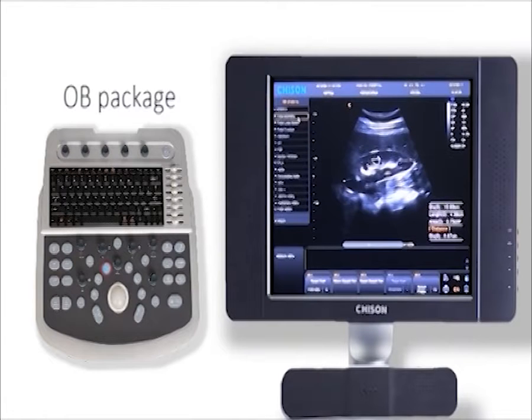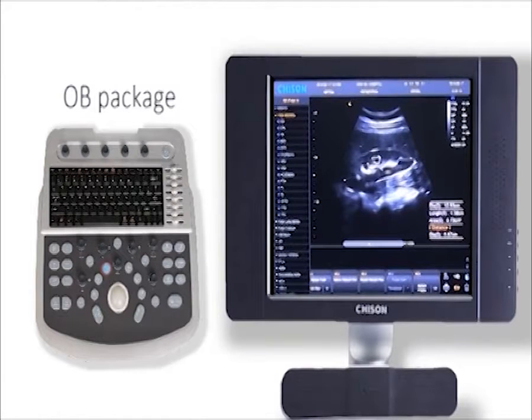For OB package, click the biometry item: GS, BPD, HC, AC, FL. Choose any one you want. It will give you more information, like gestational age and EDD.